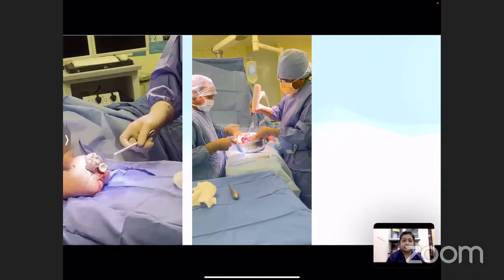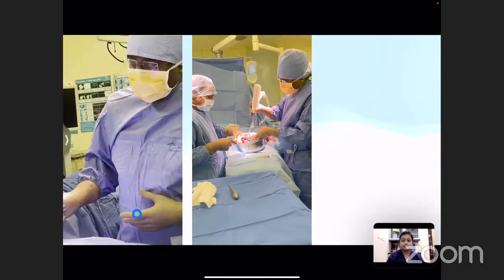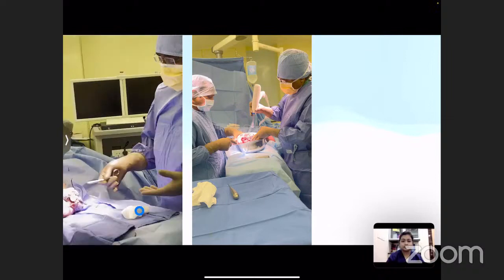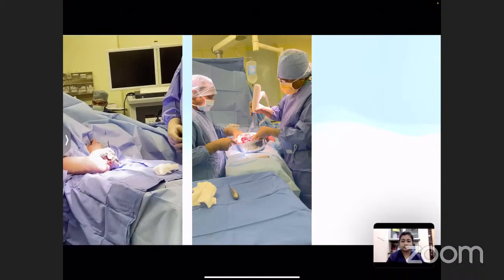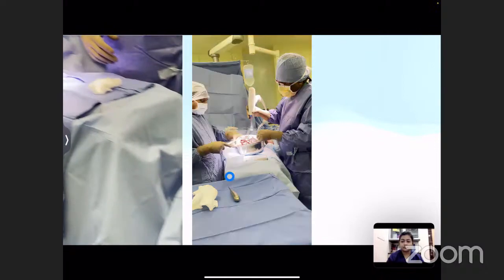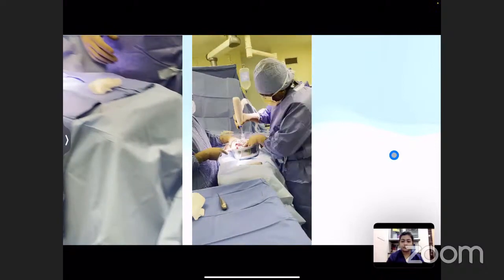Our plan is to stabilize it with the Ilizarov, and I'm also going to do bone transport of the ulna. First, thorough and merciless debridement of the dead tissues, cleaning with almost 9 liters of saline, and later plastics to cover this.